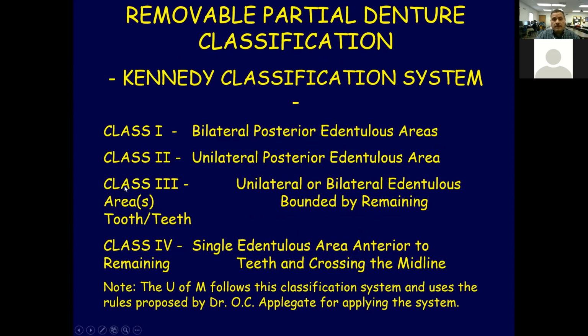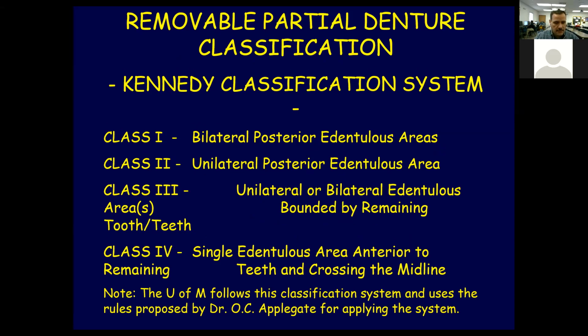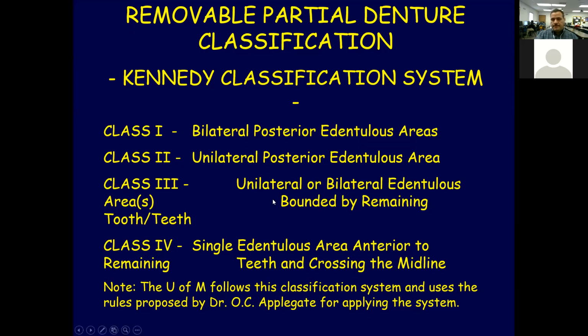So there's many classifications, but the most used is Kennedy classification. Kennedy was a guy who discovered that there's a movement of partial denture.